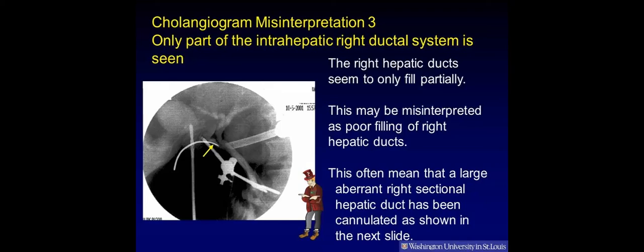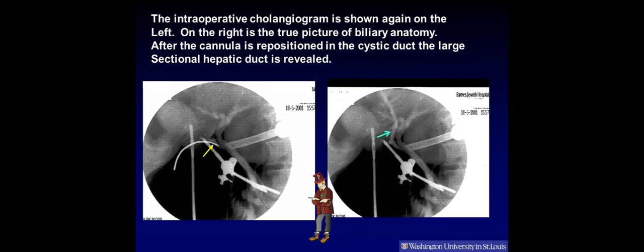Cholangiogram misinterpretation 3: Only part of the intrahepatic right ductal system is seen. In this cholangiogram, the right hepatic ducts seem to fill only partially. This may be misinterpreted as poor filling of right hepatic ducts. However, it often means that a large aberrant right sectional duct has been cannulated. After the cannula is repositioned in the cystic duct, the large sectional hepatic duct is revealed as shown by the blue arrow. Here is a close-up of the same cholangiogram.